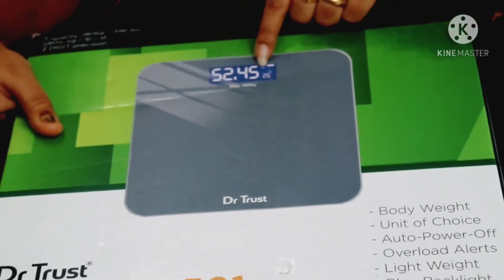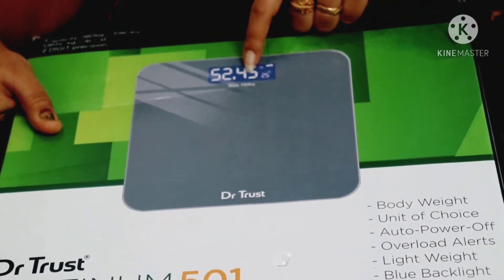There's a blue backlight display. It's a blue color.